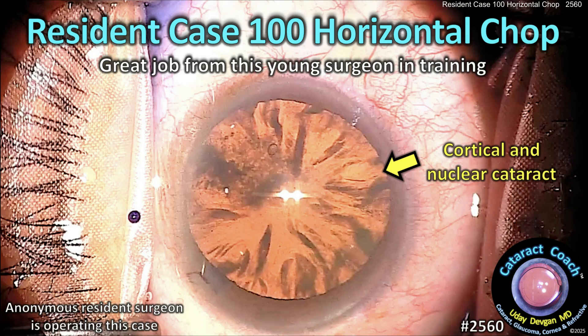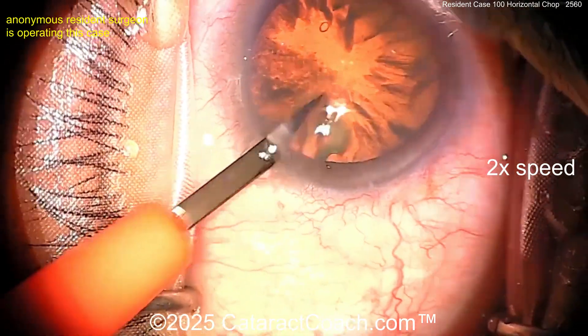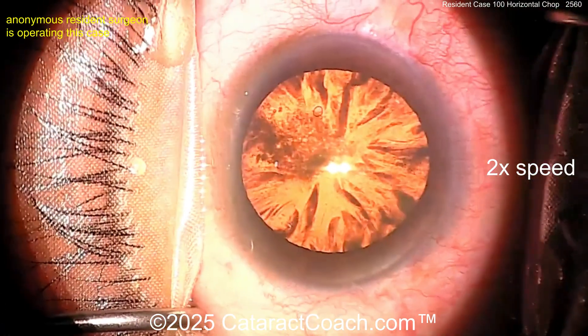CataractCoach.com resin case 100, horizontal chop. A really great job for a young surgeon in training. Let's watch the video. Starting off with good draping — I like the eye position. There's the paracentesis for the left hand.